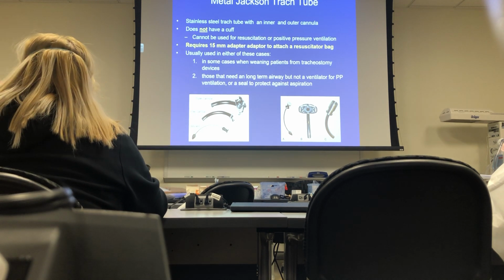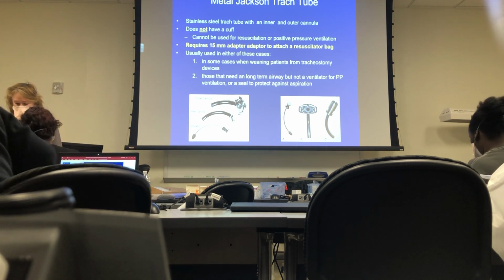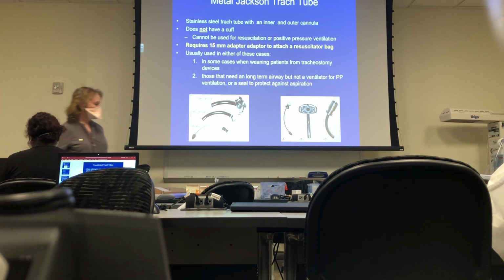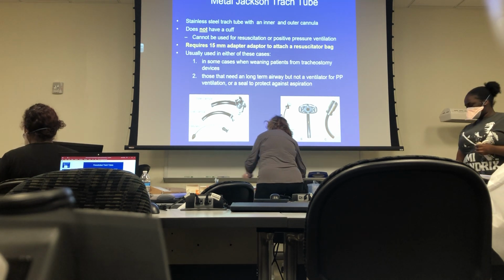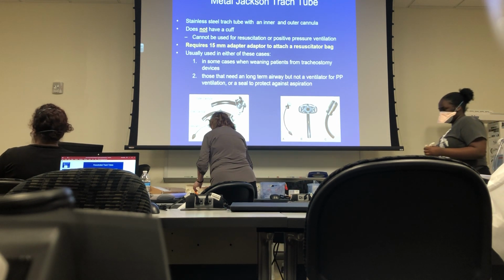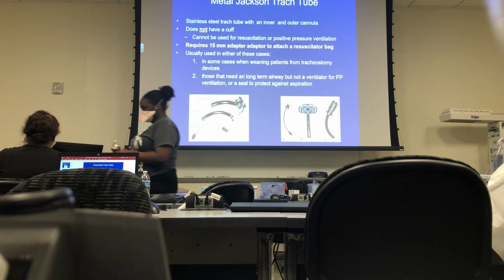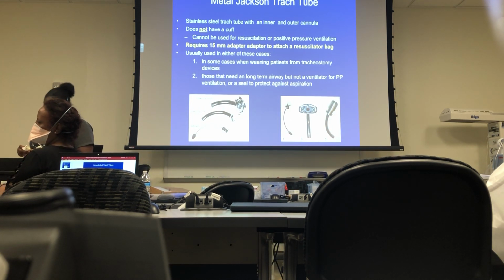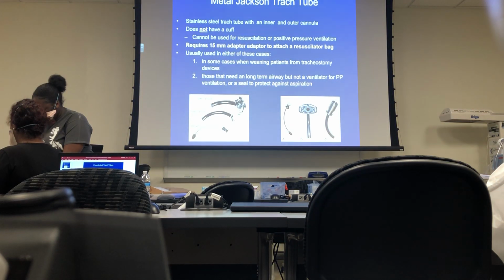Come up, and I have 3 boxes that say regular trachs. Put 2 in each box. This is for regular trachs, okay? Put them all together. And then fenestrated trachs. My orange boxes here are for fenestrated trachs, and then put the little red things in there. Fenestrated, yeah, just put them in one of those 2. 2 or 3 in each box.